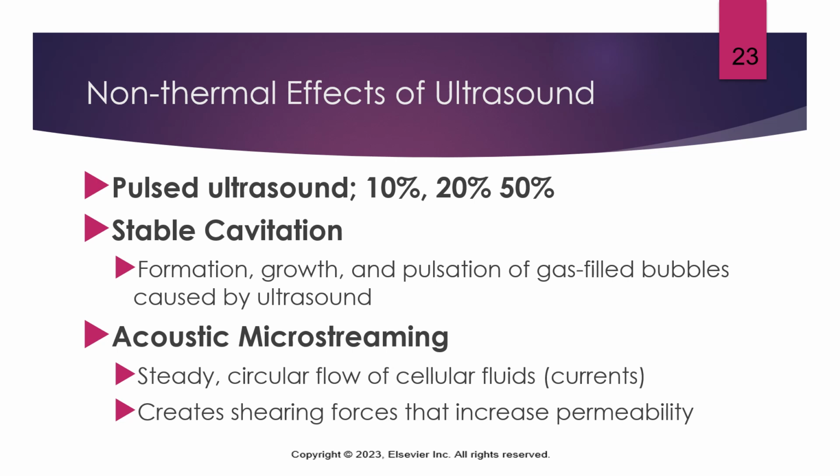You may have heard something like microstreaming before in the past, but let's just talk about this one here really quickly. Acoustic microstreaming refers to the steady circular movement of cellular fluids caused by those ultrasound waves. The effect is that it creates that cell membrane permeability again, which improves nutrient delivery and waste removal.